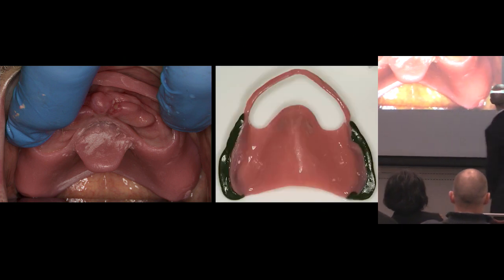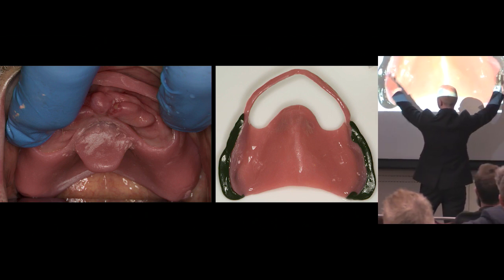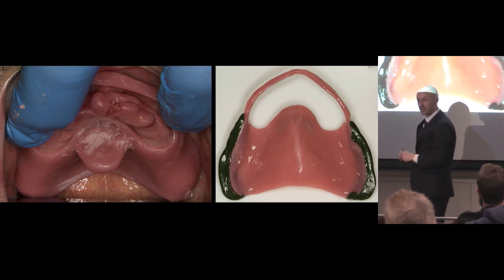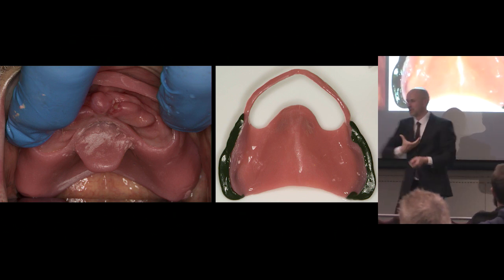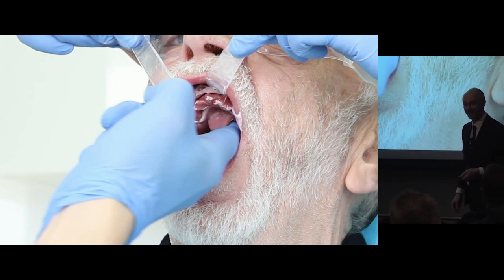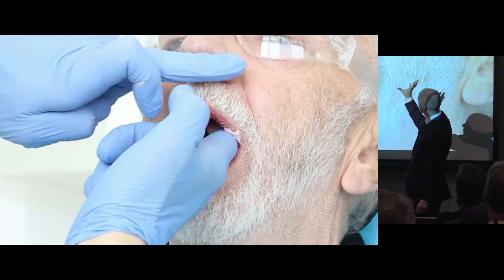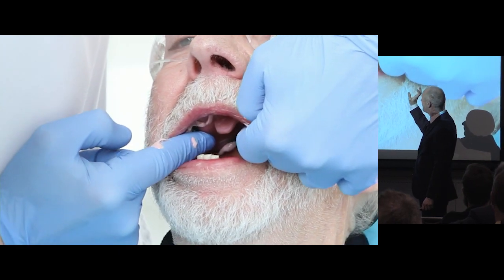And border mould here, buccally. So this is Greenstick. This is a close-fitting special tray, ready for zinc oxide eugenol on there. So Greenstick goes into the mouth, and I do various movements, which I'll show you when I do the zinc oxide, because it's just the same movements. So here we go. We've got Bert's here in the mouth, and I push that up right onto the saddle, and then push it firmly.